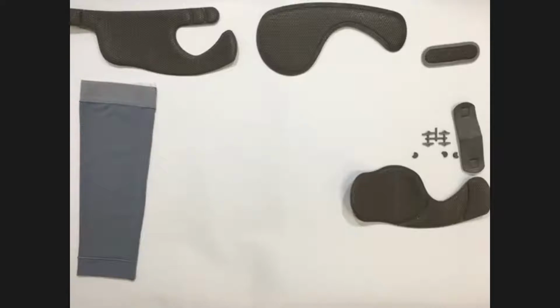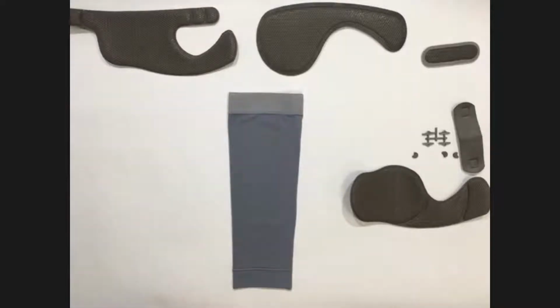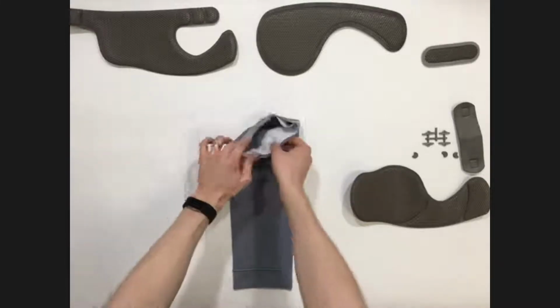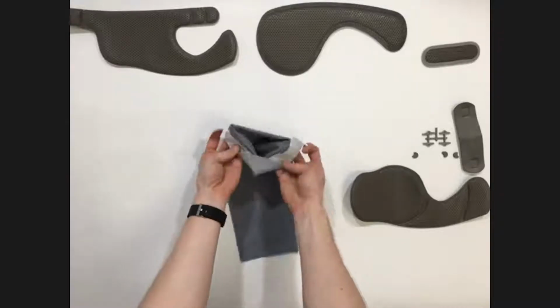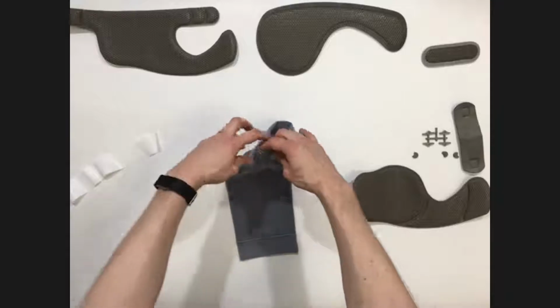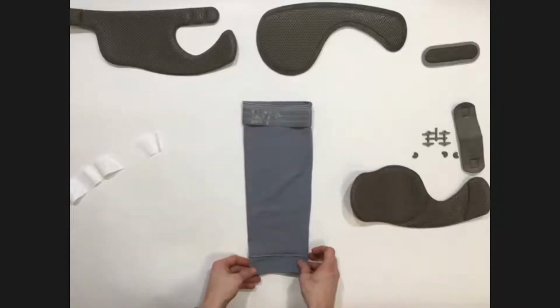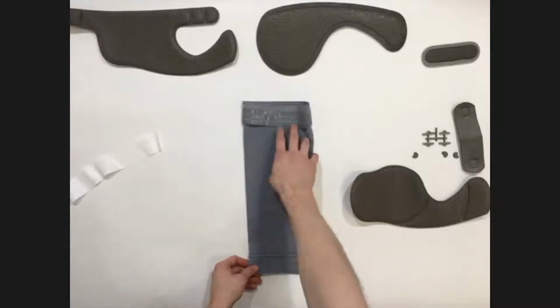There are different sizes of these according to the size of unloader that you use. So these are sized to be exactly the same, similar color as we have with the unloader, and it's a lycra-based material. It does have a small section of silicone at the top. This has this protective covering on that. So we're now going to take this over to Pete and then begin to fit the brace with this sleeve underneath.